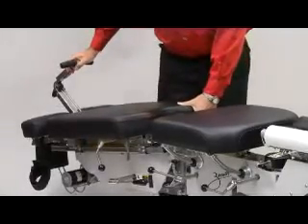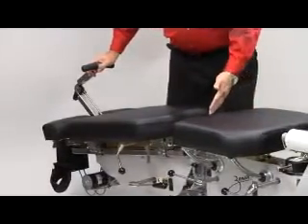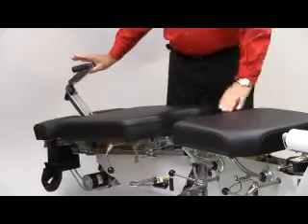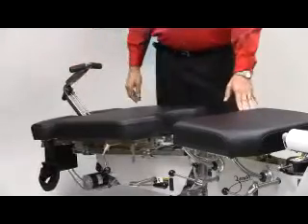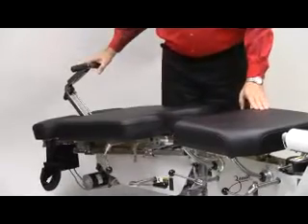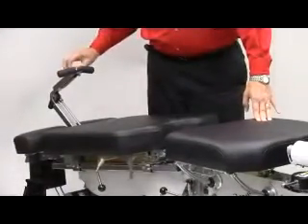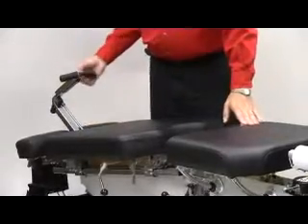The next feature we'll discuss is the automatic axial distraction system, which is great for decompression therapy. The table is on and ready for treatment. It allows for a total of 10 inches of treatment, automatic, and all I'm doing, doctors, is pulsing the button. I also have available a foot switch on the floor that I can treat full spine due to foramen magnum pump. There's a speed control for slow pulse or at the most rapid speed. Of course, it can be shut off in any position to allow for traction, for static, or for mobilization.